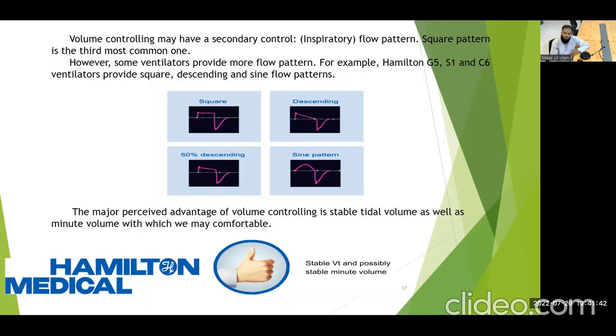The major perceived advantage of volume controlling is a stable tidal volume as well as stable minute volume, with which we may be comfortable.